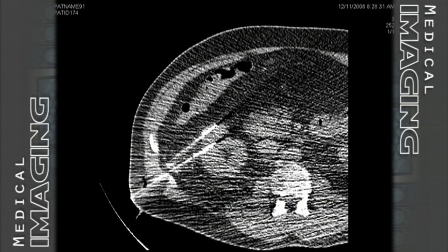Now from this point on, they may or may not introduce a third needle, which will be the cryogenic probe that's used to freeze this area. They could introduce the probe through one of these existing needle shafts and then slide the probe all the way down and place it in position within the tumor. Further images will give you a clue as to what was done.